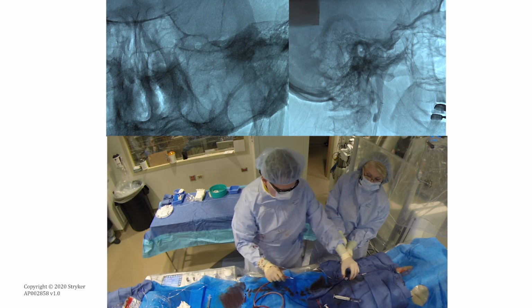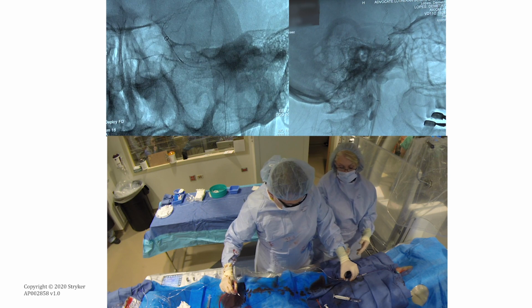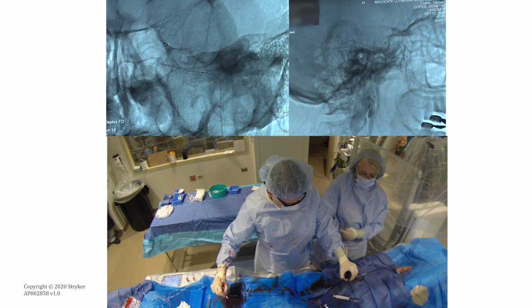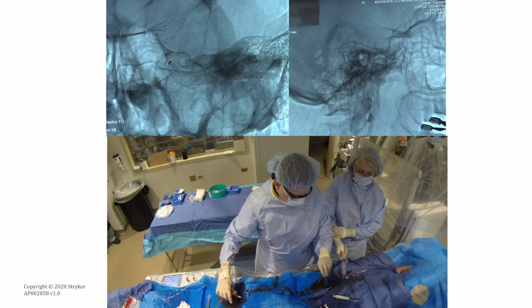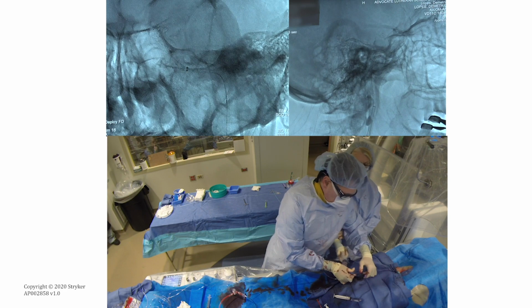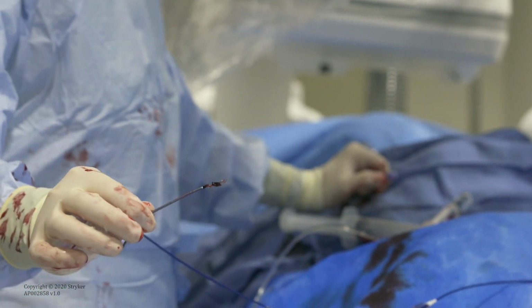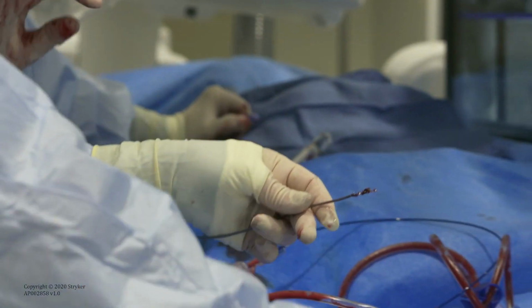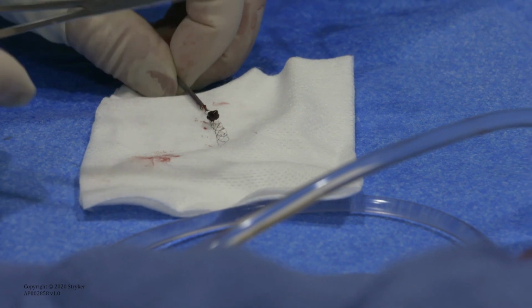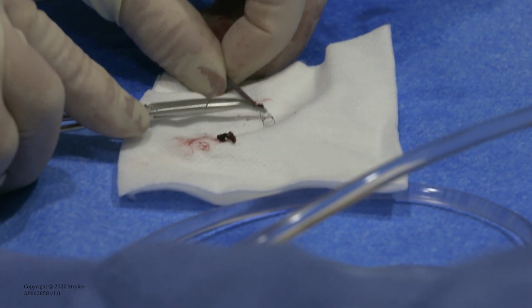Now a very important step here is that we open the rotating hemostatic valve so that the Trevo can pass through it without flaking off any clots. The balloon guide is still up, and you can see that I tend to disconnect and allow for back bleeding. You can see that the clot is in the middle of the stent retriever, showing why the length is always important, having a 30, because the clot didn't roll out of the stent retriever.